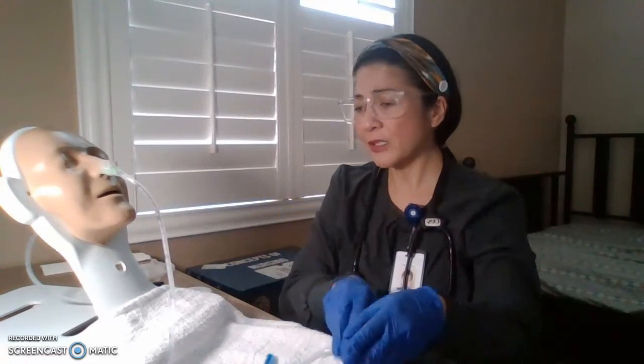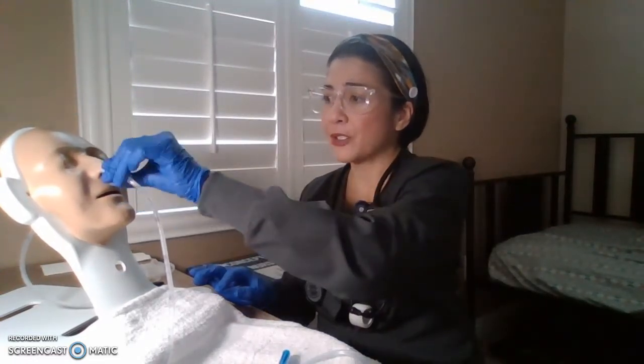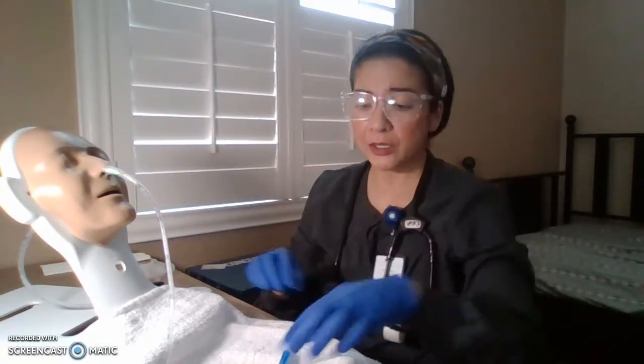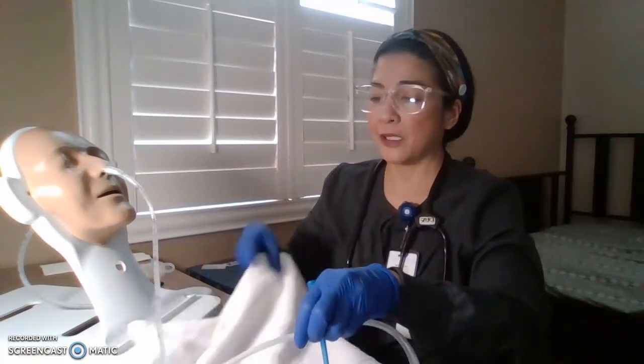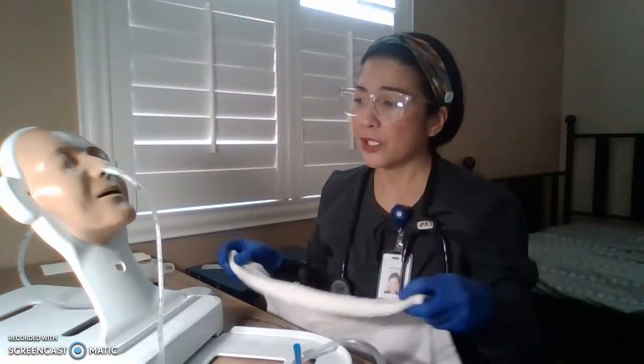Okay. So now that that is secured, I have to ask the patient, are they comfortable? Put the bed in the lowest position. Okay, make sure he is safe. All right, and he's comfortable. Is there anything else that you need, sir? We are actually finished. Are you breathing well? Yes. And you've checked vital signs. Pulse oximeter is also good to have handy with you.